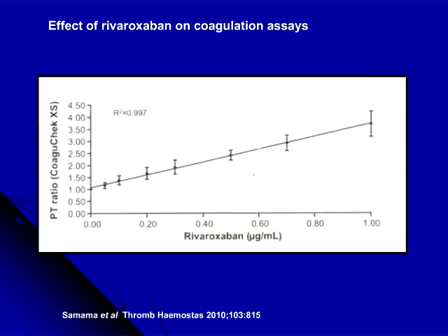And increasingly important is going to be point of care or near-patient testing, particularly in the operating centres, particularly where there's decentralised anticoagulant services. And I put this up just to show that it would be feasible to use point of care instruments to determine the anticoagulant effect of a drug, but we still need a lot more data, and here, as much as anywhere, the necessity for internal quality control and external quality assurance is going to be absolutely key to the correct interpretation.